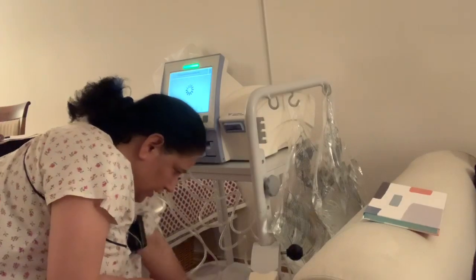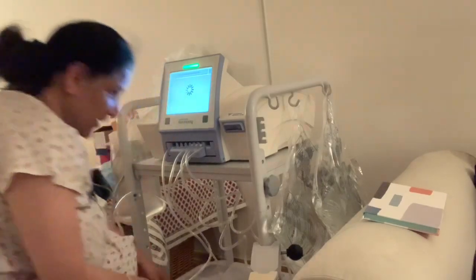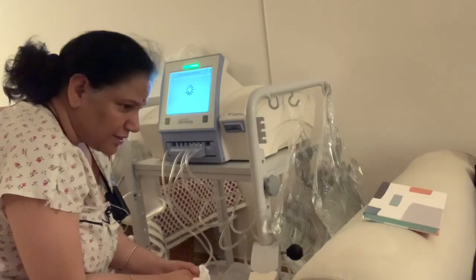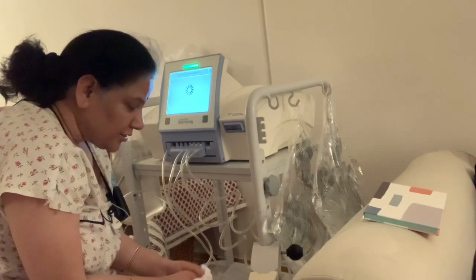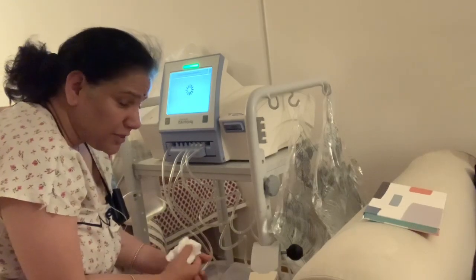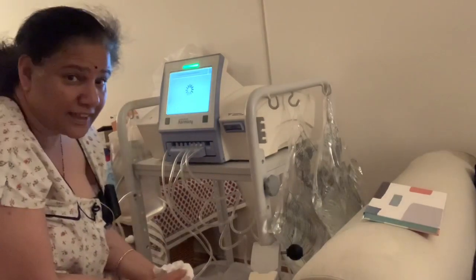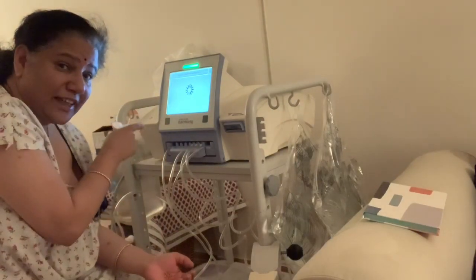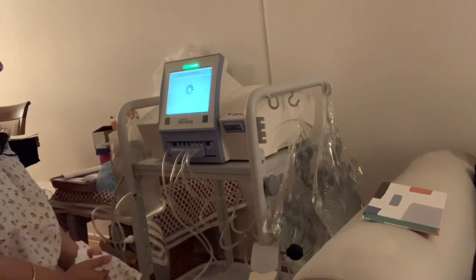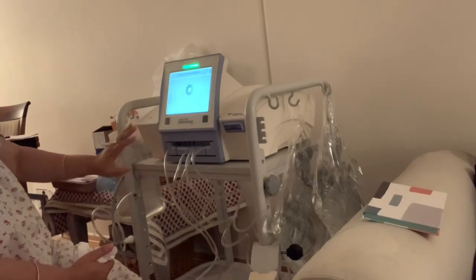I'm just checking everything is working. It's a long process, and sometimes we experience really funny stuff — like the machine deciding not to work. It beeps in the night with quite a loud alarm. Now the little shelf is going completely in; it's all ready.